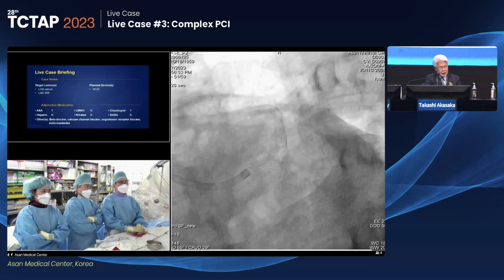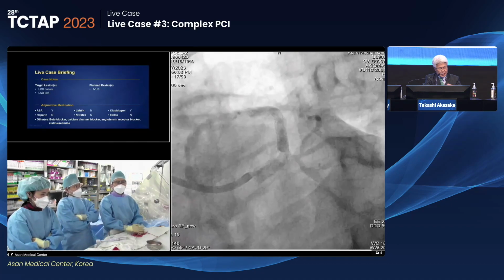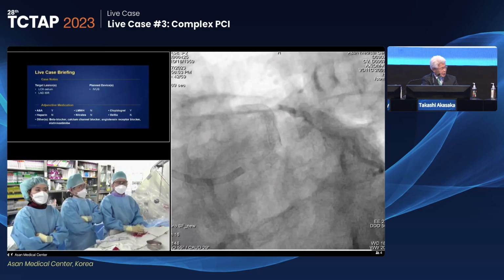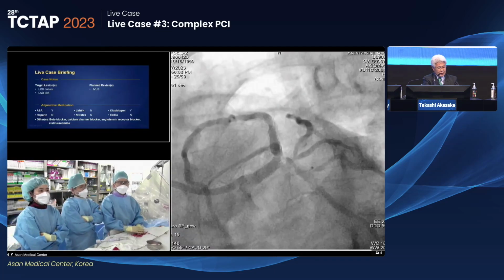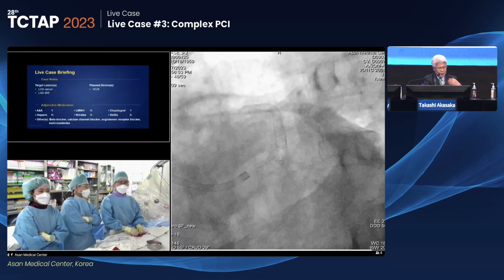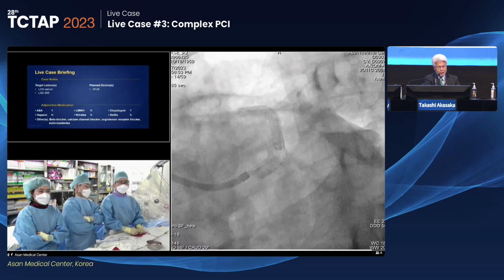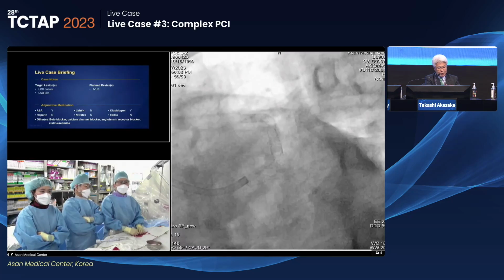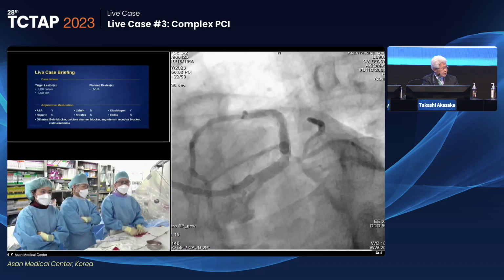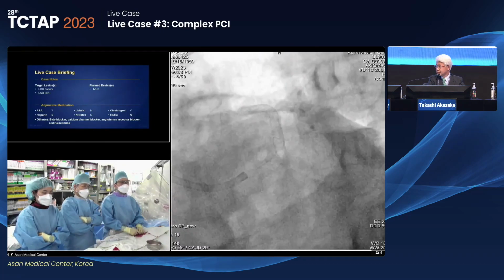Yeah. The reason why I asked is that tissue growth at the side branch orifice is sometimes a little bit complex, and guidewire crossing at the time of restenosis is very limited, right? So if you have enough stent strut treatment at the time of initial PCI, it might be much easier to cross the ideal cell. That is the reason why I asked you, right? But just to open the struts to facilitate retreatment then?